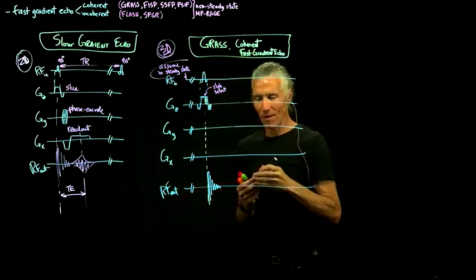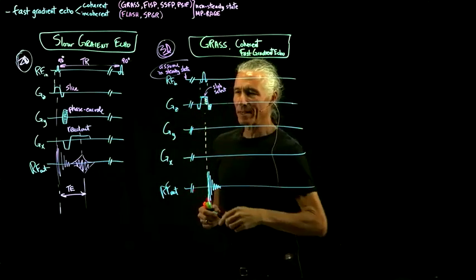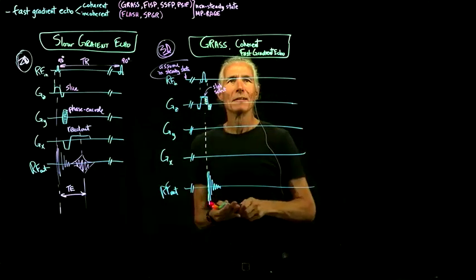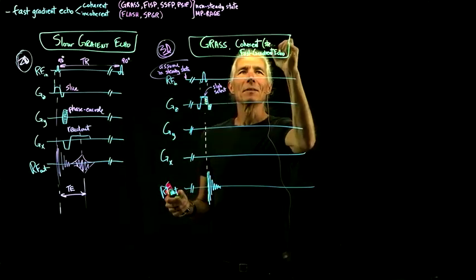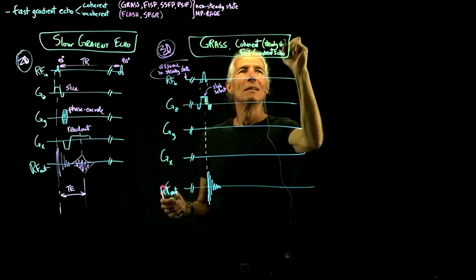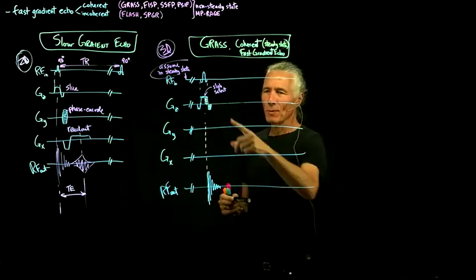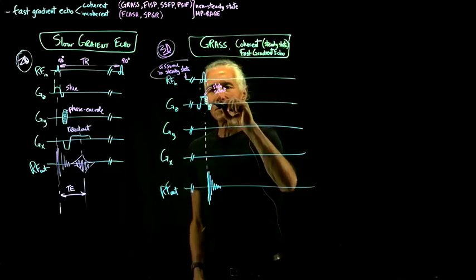So you have to have a balanced setup where we take into consideration that we've got some magnetization, coherent steady state magnetization. Put that in there too, just for good measure. So that's one difference. That's not a very big difference. And then we have to do our phasing code.